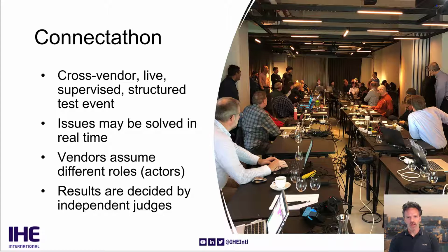The thing with Connectathons is that not only do they prove which profiles work, but vendors also typically send developers who can fix problems in real time or during the evenings and mornings when testing is off.